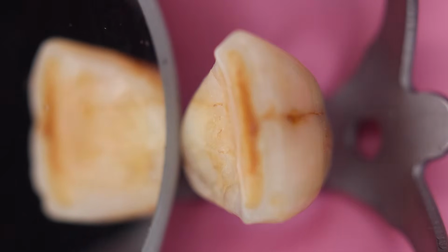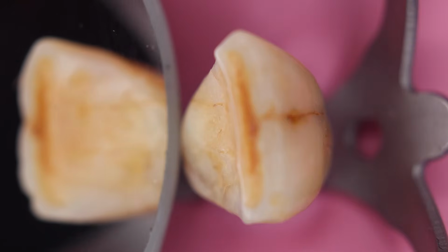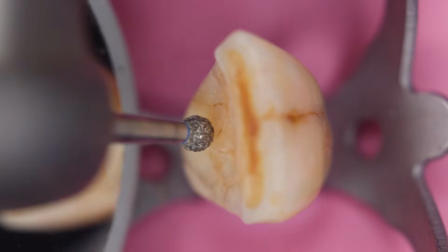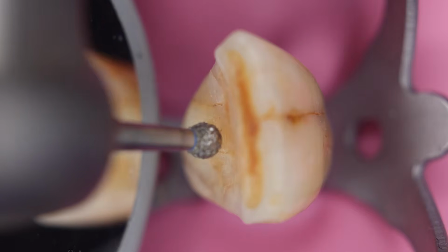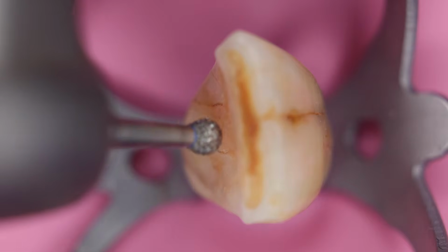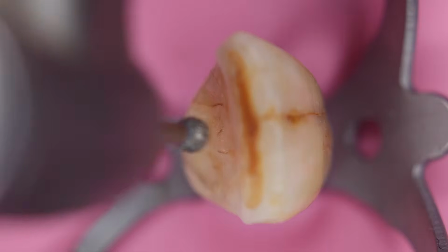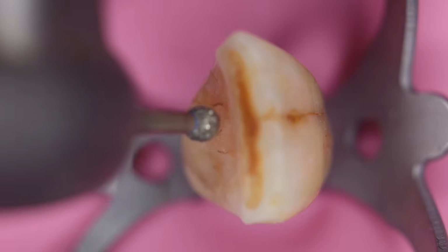Now, considering the fourth aspect, what should be your burr to initiate? Initially you can use the endo access burr or the round diamond point. The angulation for this access, when approaching from the central approach or the bisecting lines we have demarcated, is that initially the burr should go at a 45-degree angulation. This is the vertical axis of the tooth directly going down, and we angulate the burr up to 45 degrees like this, and let the head of this burr go inside.